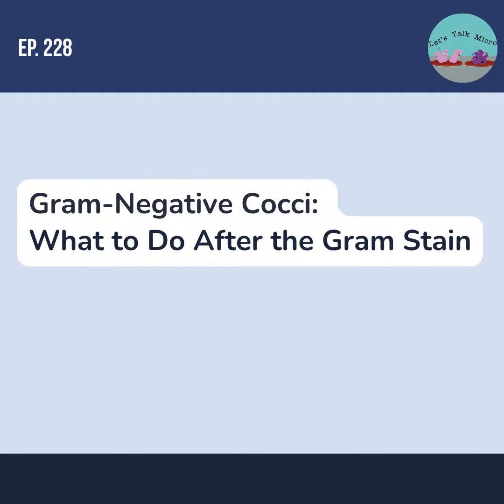And different Neisseria species produce different patterns. They ferment different sugars. For example, Neisseria gonorrhoeae ferments glucose. Neisseria meningitidis utilizes glucose and maltose. Neisseria lactamica utilizes glucose, maltose, and lactose. And a fun way of learning that is that, starting with gonorrhoeae, you associate the letter of the species with the sugar.